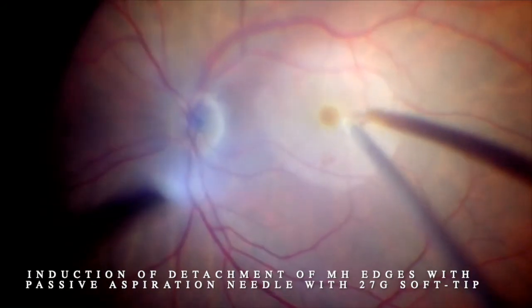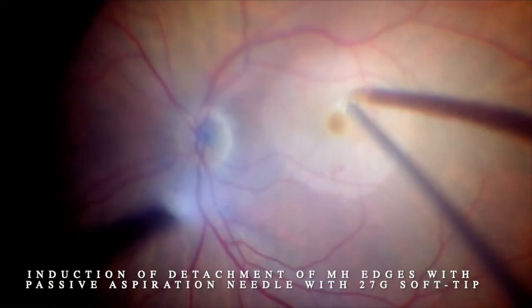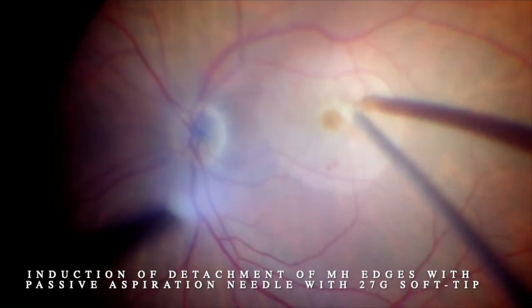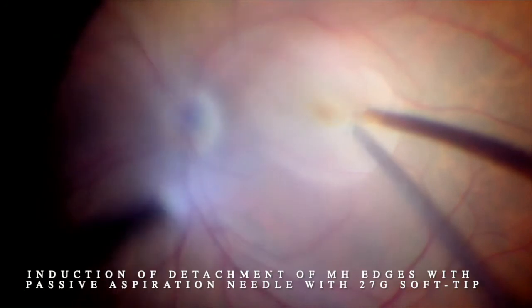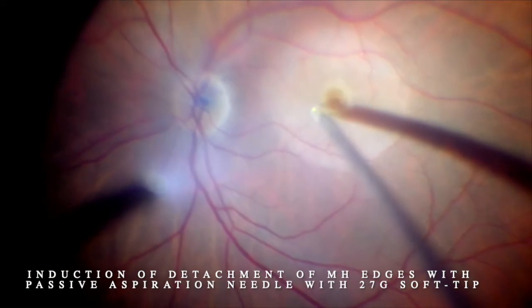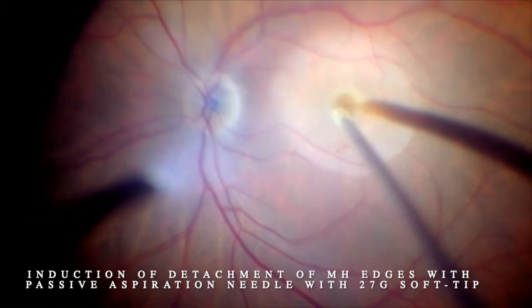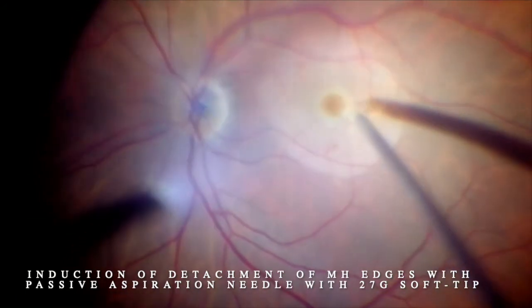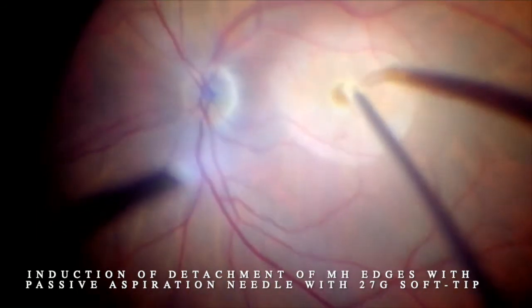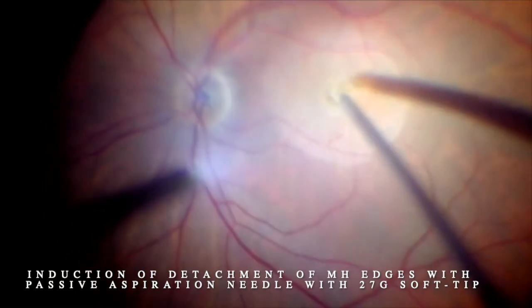The human amniotic membrane can work as a scaffold or plug, but we know it is also rich in growth factors. It has a monolayer of epithelium, a thick basement membrane, and an avascular stroma. The stroma is adhesive, so we want to place the stromal side on the retinal pigment epithelium, and we want the monolayer epithelium of the amniotic membrane facing towards the neuroepithelium of the retina.